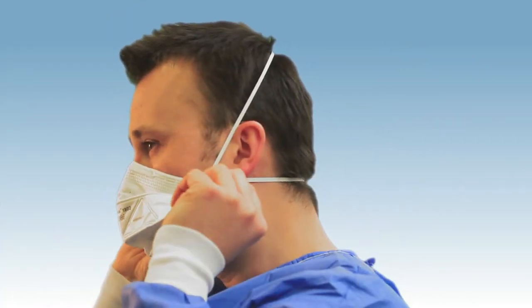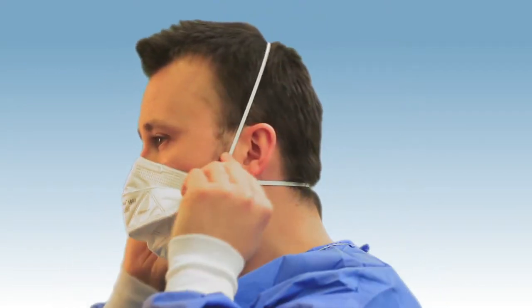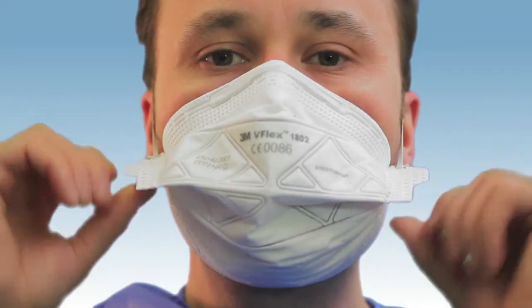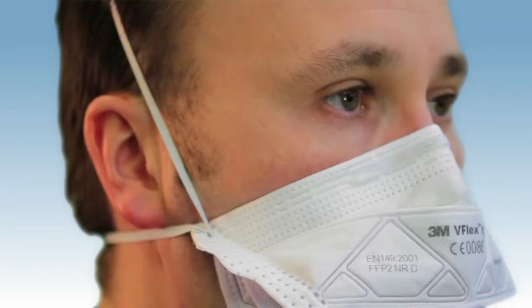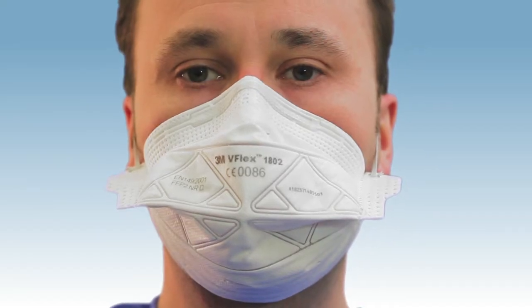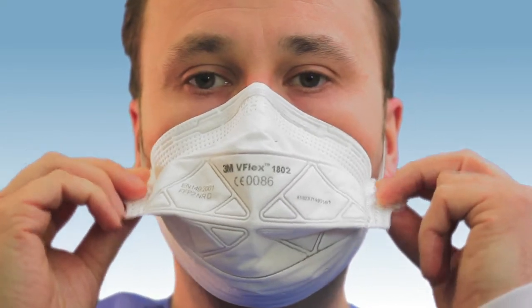Check that the straps have not become twisted, then ensure the respirator is completely unfolded on your face and let the edges lie flat against your skin. Adjust until you achieve a comfortable fit using the tabs on the side.